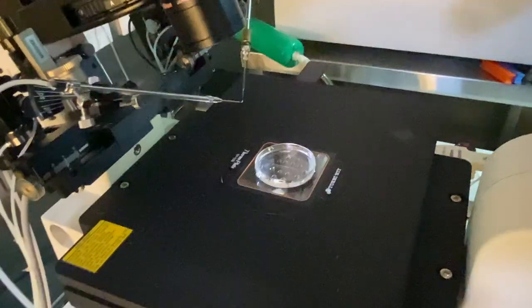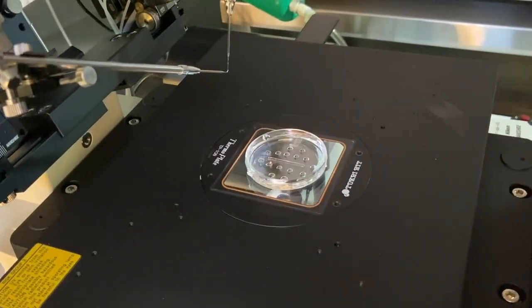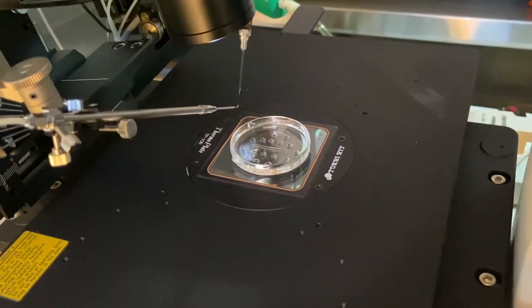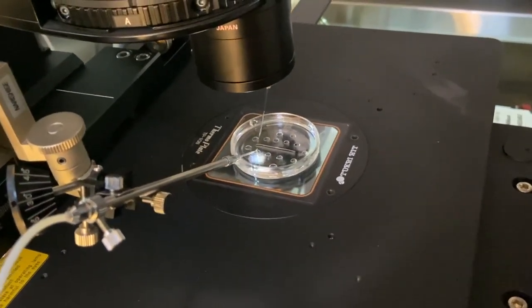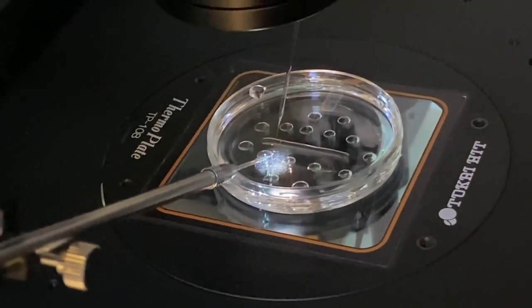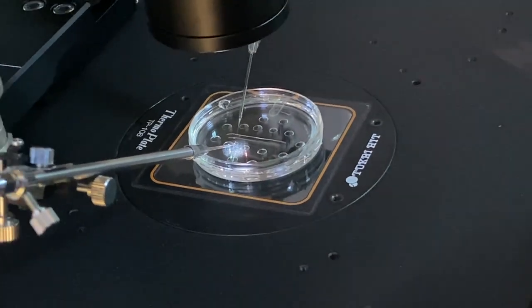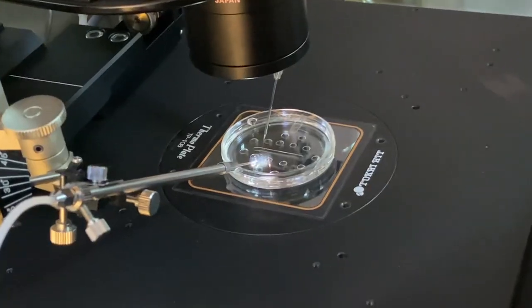Now I will show you how to prime our ICSI holding and injecting pipettes before starting our ICSI procedure. Slowly I will drop them inside the oil, for example in between droplets. They are already aligned, so I will just put them inside the oil so that some of the oil can go inside the pipettes.